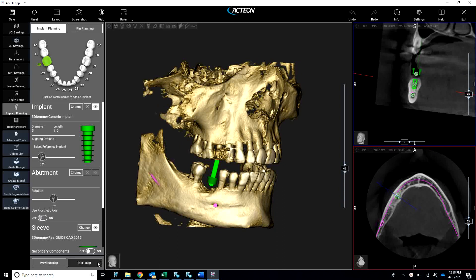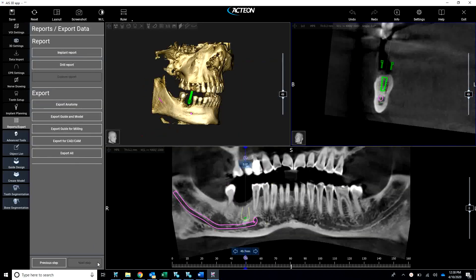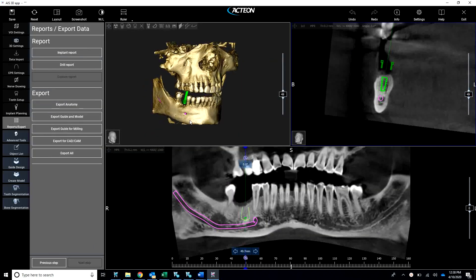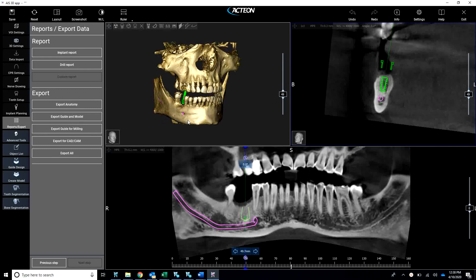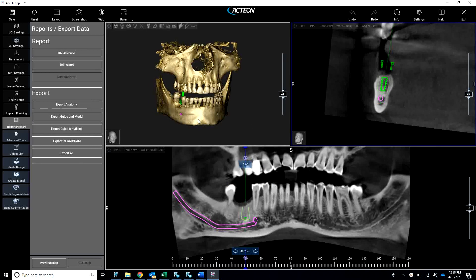We're going to go to next step, and right here is pretty much it — we're done. It's as easy as that. You can export the anatomy to the lab or your 3D printer and you're ready to rock and roll. Thank you. I look forward to talking to you next time.